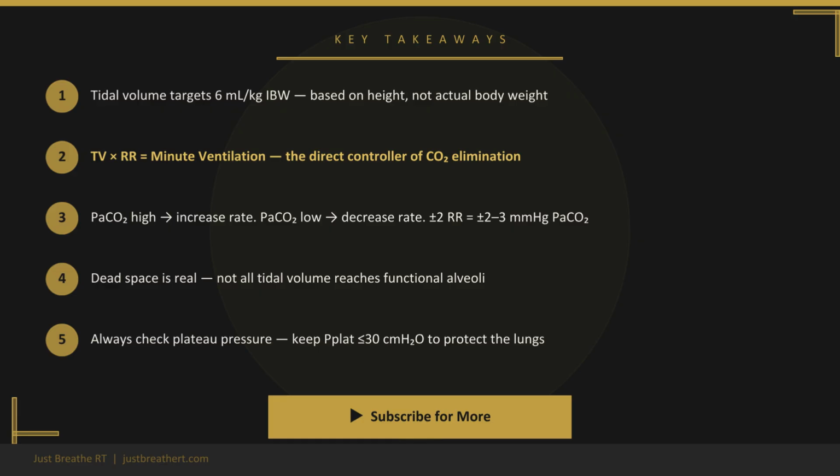Remember that not all air reaches the alveoli. Dead space is real, and it matters in your sickest patients. And always verify your tidal volume with plateau pressure. Keep it at or below 30 centimeters of water, because the volume that looks safe on paper can still be causing harm inside those lungs.